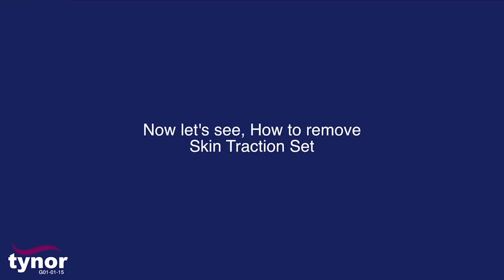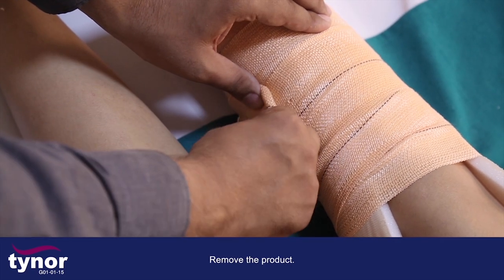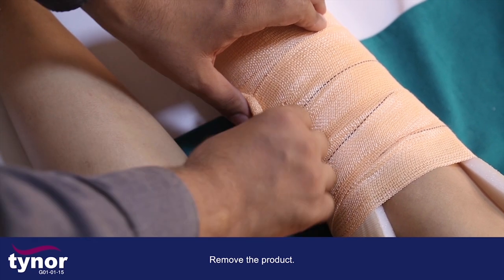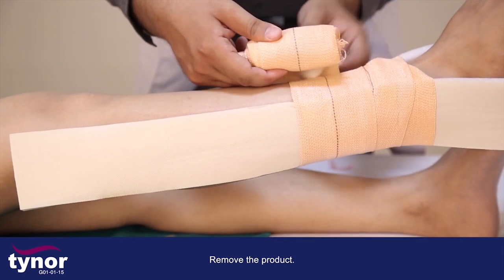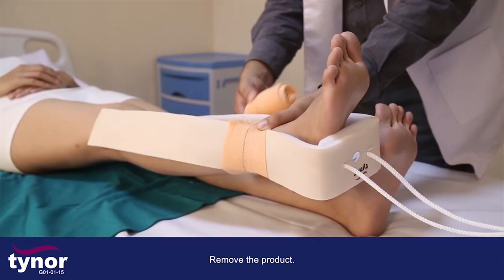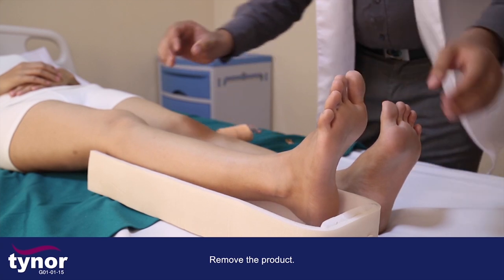Now let's see how to remove the skin traction set. Gently remove the weight, then gently remove the product.